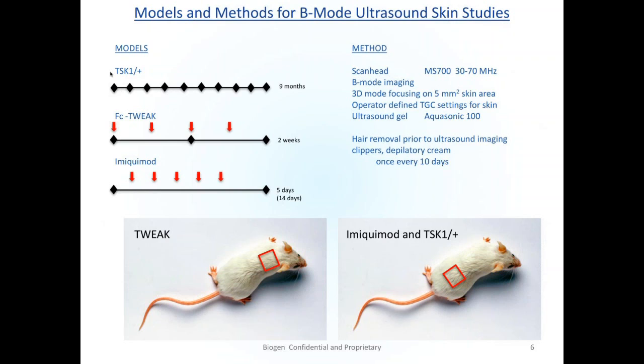The TWEAK model is done with biweekly injections of this soluble cytokine. So this is a subcutaneous injection of this material. And this is done over a 2-week period, and this has been defined as a time point that would give us some useful readouts.